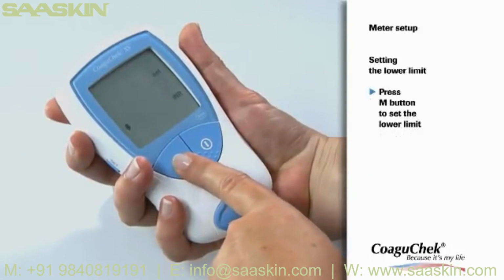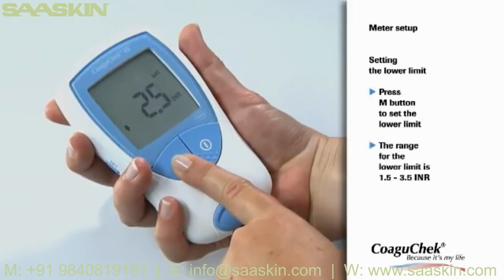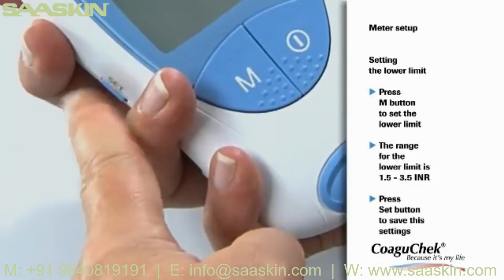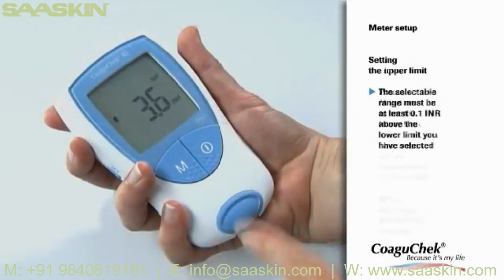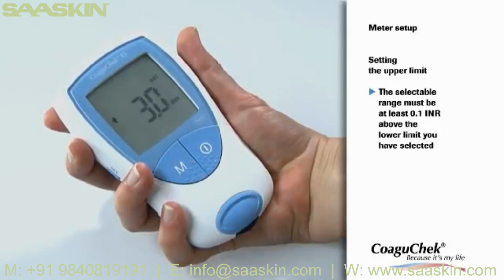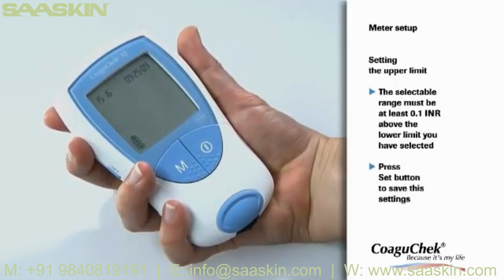Consult your doctor about which target range is appropriate for you. Please press the M button to set the lower limit within the range, 1.5 to 3.5 INR. Press the Set button to confirm. Now press the M button to set the upper limit within the range, 2.5 to 4.5 INR, and again press the Set button to confirm.